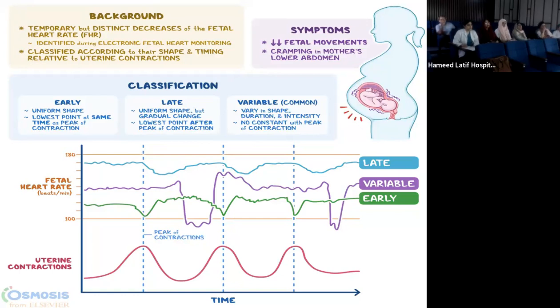Okay. Late deceleration. So these purple colors show the late deceleration. Blue one, yes, blue one at the end of uterine contraction. ठीक है. Basically it is associated with the contraction.